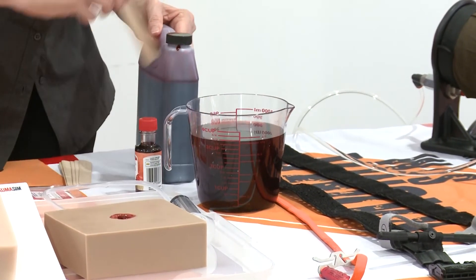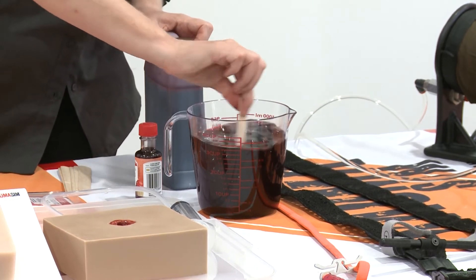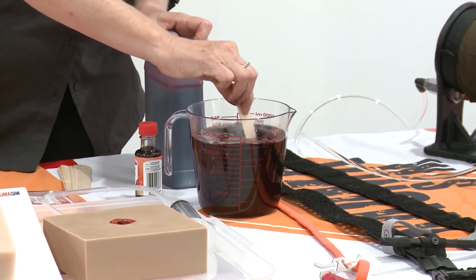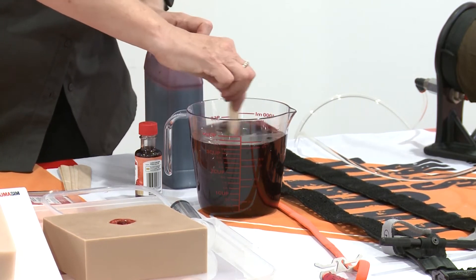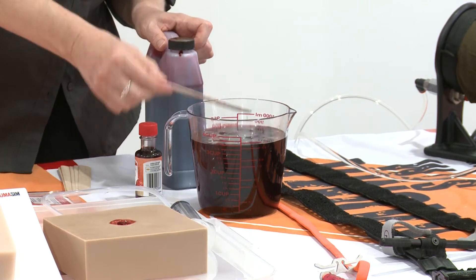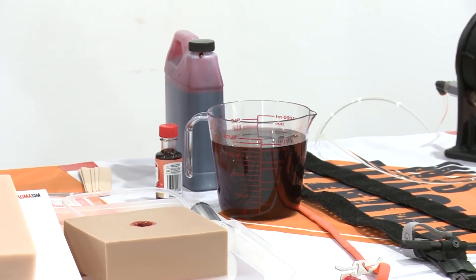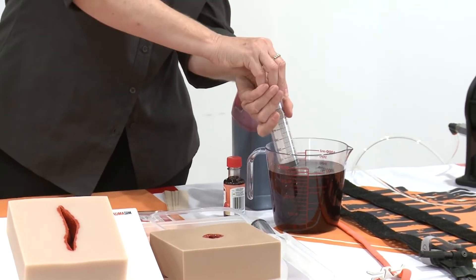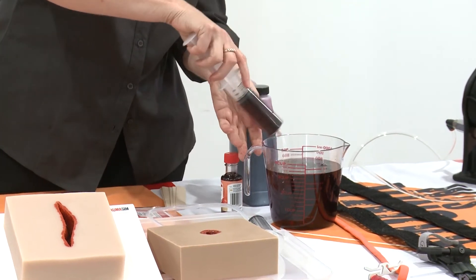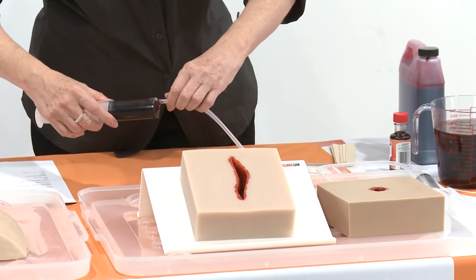The other thing about using a professional grade product as your blood rather than cooking something up on the stove is that you have a safety data sheet for it. If you're doing it for clients and industry, you will often have to provide safety data sheets for everything you do — anywhere where anything's coming into contact with people, you have to be able to prove that it's safe and been tested.